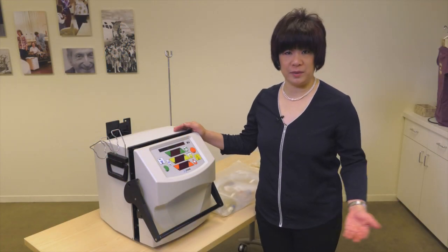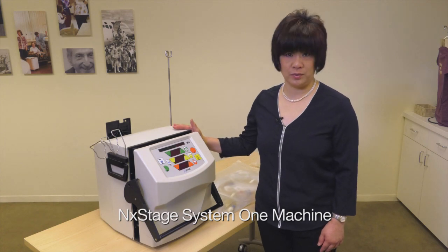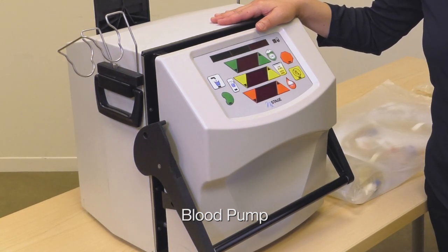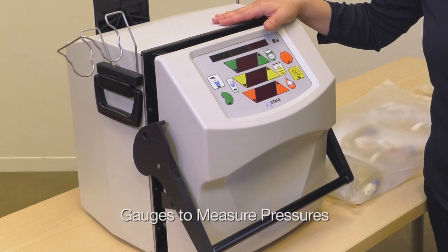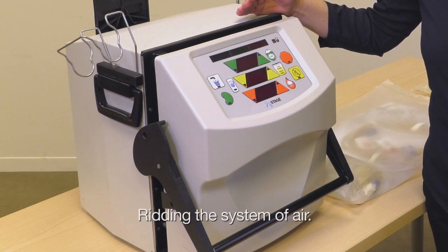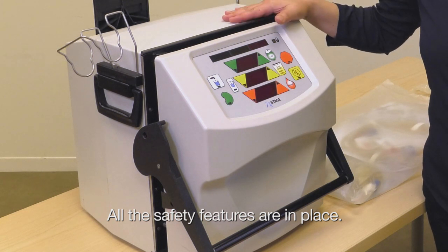For those that are familiar with the big machine, there's a big difference — this is relatively portable. Inside this machine, they also have a blood pump to pump the blood from the patient and back to the patient, a dialysate pump, gauges to measure pressures, air detectors to detect air, and a clamp to clamp off the line to prevent air from entering the patient's body. So all the safety features are in place.